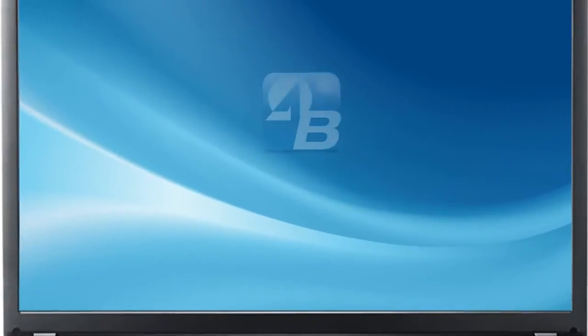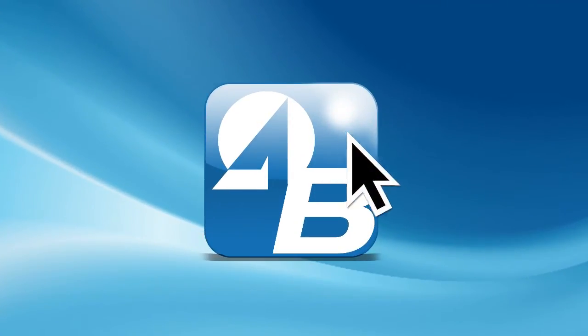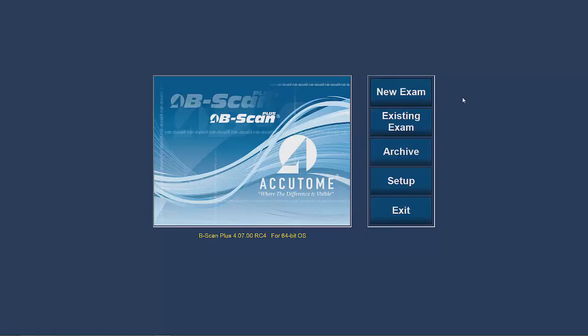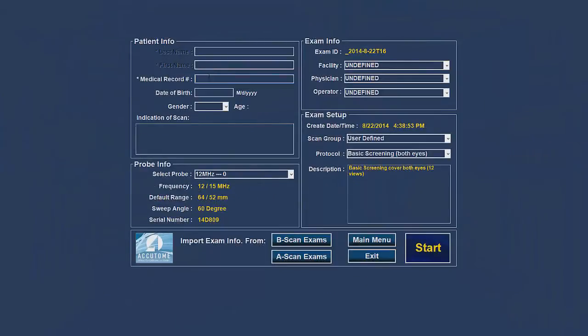On the desktop of the computer is an Accutome logo that is installed with the software. In order to start the software, simply double click the icon. The software will start and you will see a full blue screen program with five options on the right hand side of the screen: New Exam, Existing Exam, Setup, and Archive. Click on the New Exam tab and fill out the appropriate patient demographic information and then click Start.